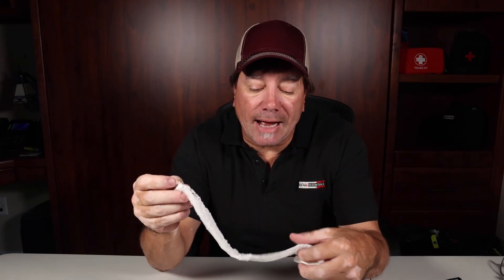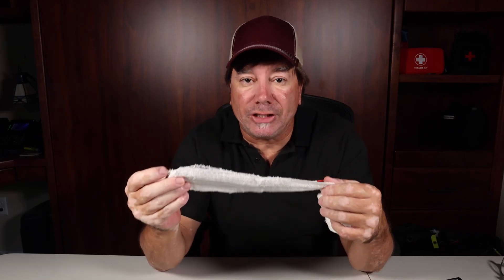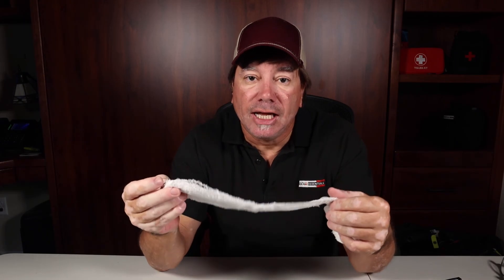So if you have wounds on spaces where you don't want to or can't utilize the elastic bandage, you can wrap it with a short section of the compressed gauze and then utilize some of the duct tape to secure it into place.